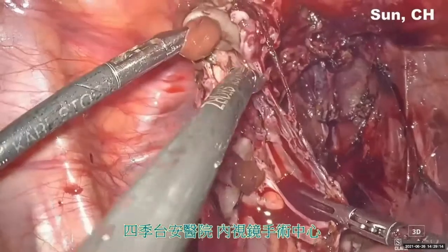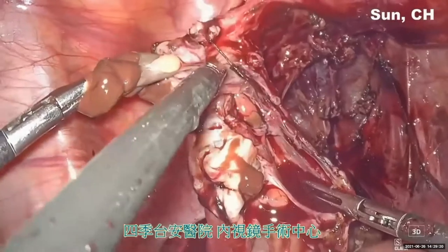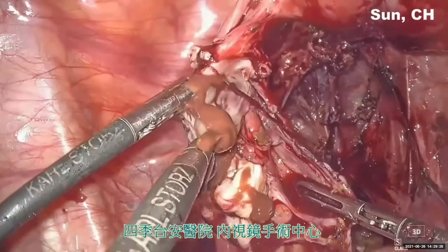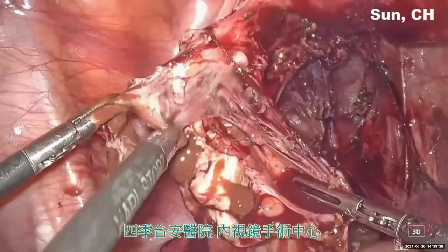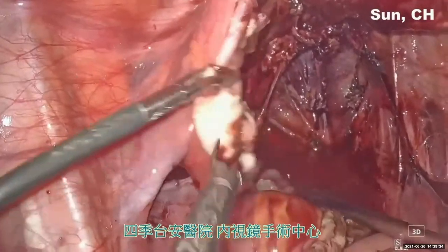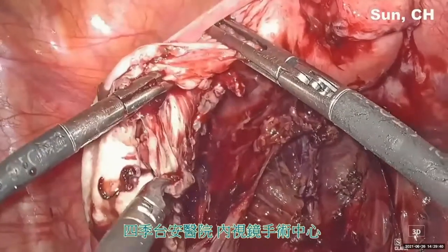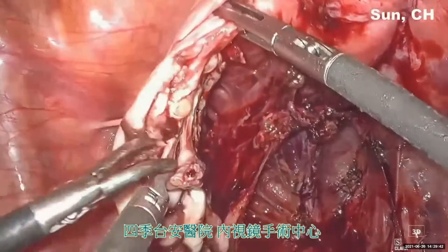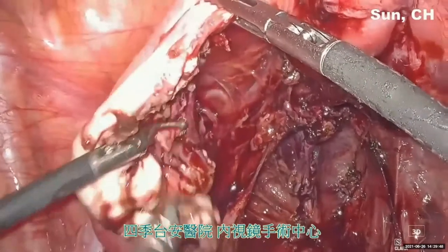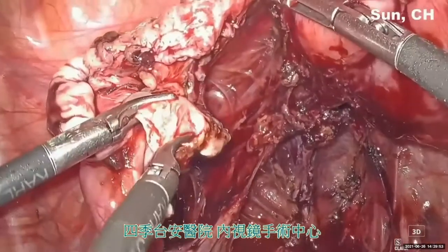You can see I'm not using any sharp scissors and I'm not using any energy. I only use the blunt dissection, very, very careful blunt dissection. And if you are staying in the correct tissue plane, the correct cleavage plane, you see there will be no bleeding, almost no bleeding. There is still a little piece of cyst wall.